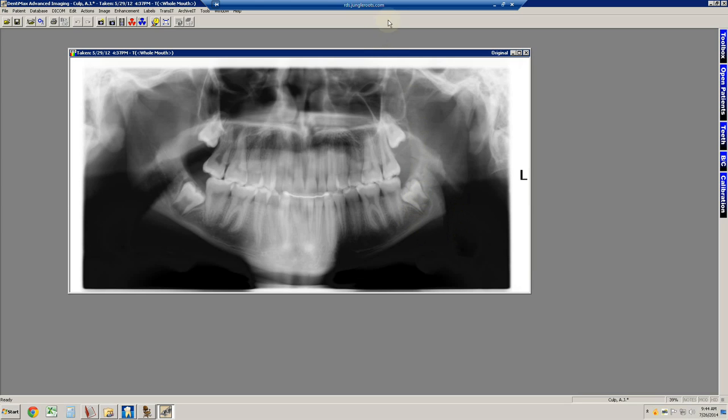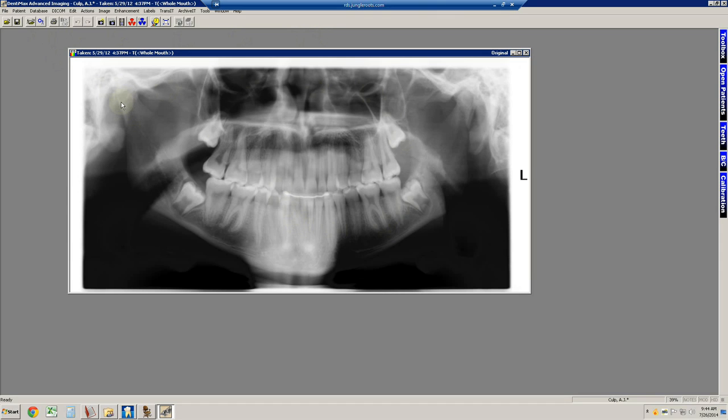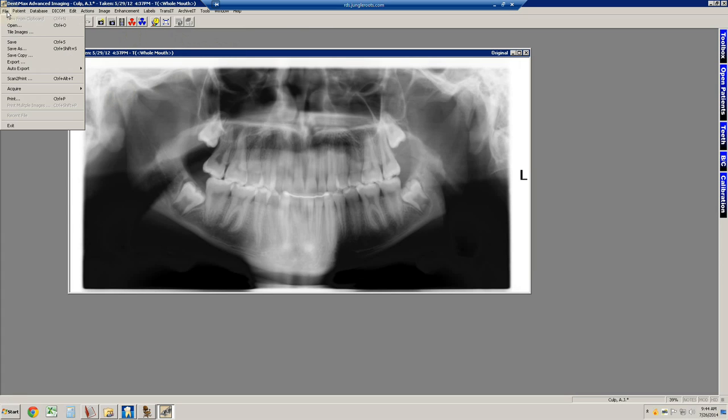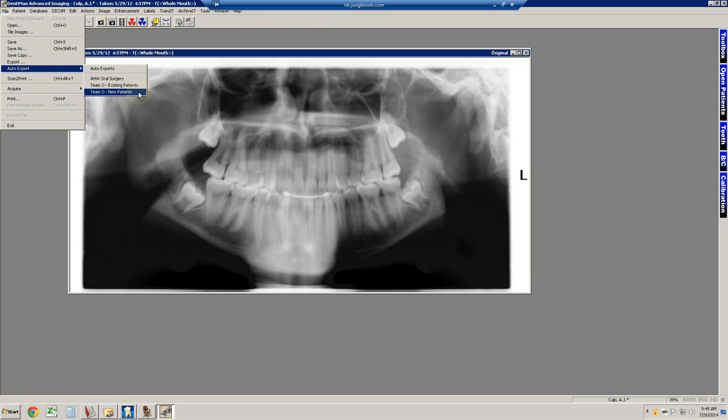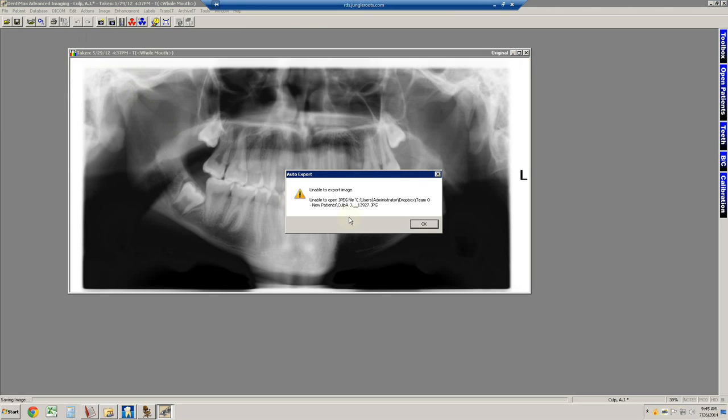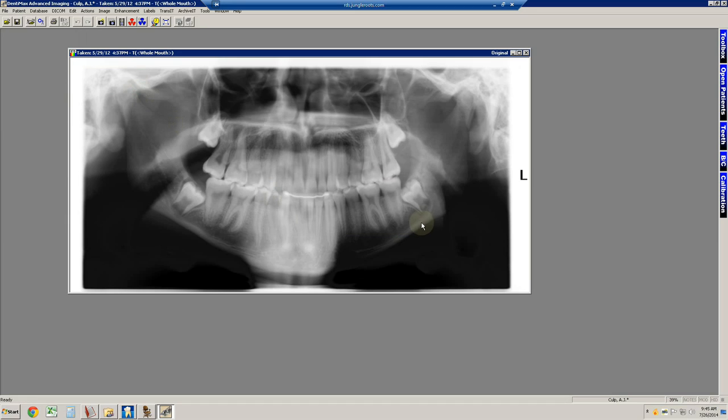This function will not work on a remote connection that we have with Dentrix. When you see this bar at the top, it's not possible to do that. There are some limitations, but when you are in Awatuki and you're on the hygiene side, it's very simple to do that in exactly that same way. Say, for instance, this patient needs to be seen by Dr. Daniluk. We have also highlighted the top screen here, File, Auto Export, and then we have him as two setups. We have new patients that we're referring, and if we take an image that he's requested, we can indicate that as existing patients. In this case, AJ is going to be a new patient. As quickly as that happened, this image is whisked away to their Dropbox and is synced literally within 10 seconds, and they have it, and it's done. Good information there, very helpful, very useful stuff.